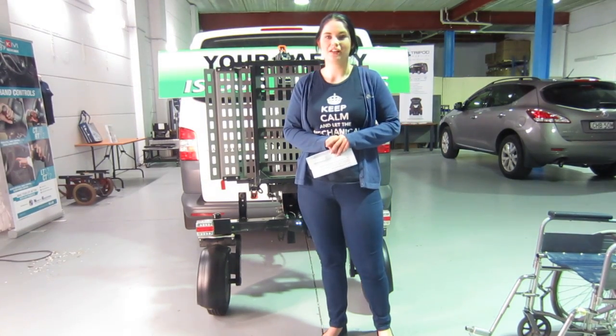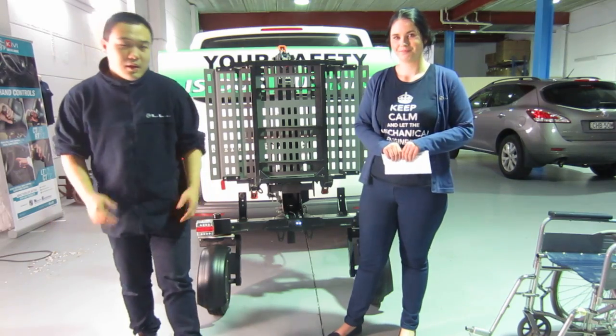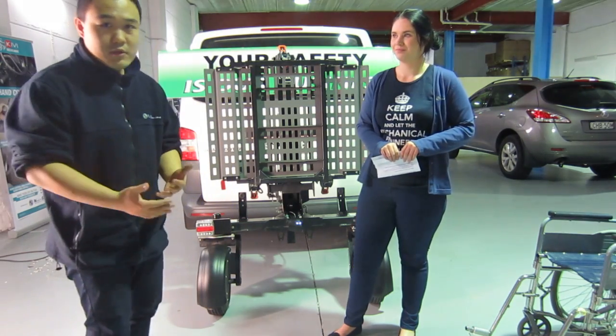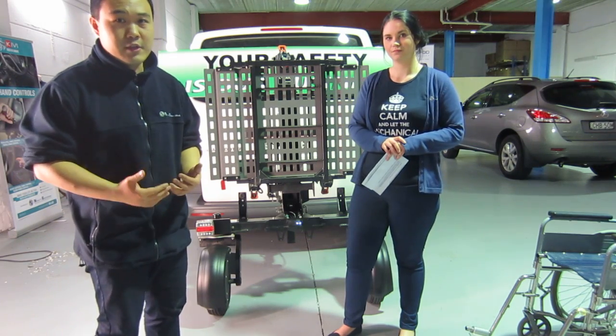Hi guys and welcome to another one of Mobility Engineering's product information videos. I'm Jasmine and this is Shen. Today we are introducing you to a very exciting product, which is the Bruno ASL 700 Chariot.